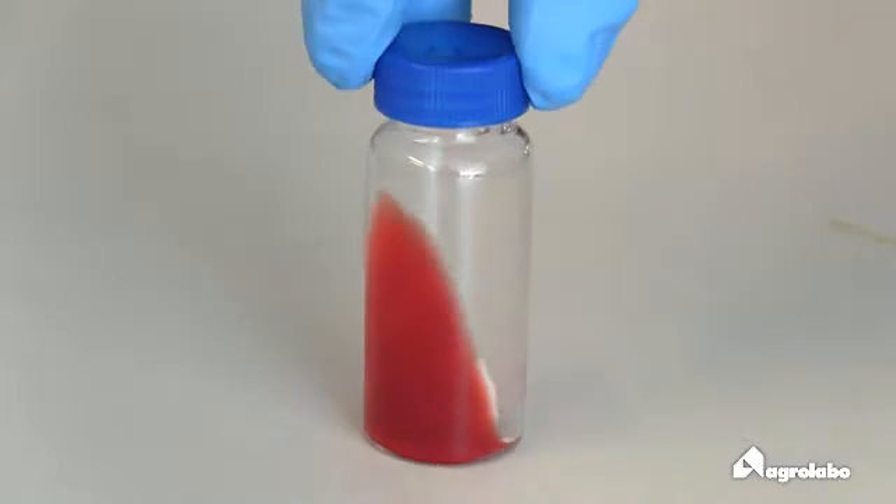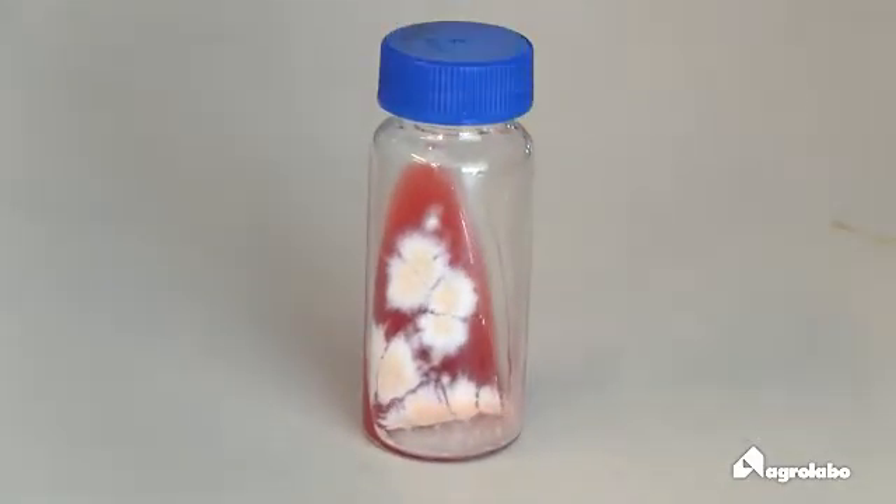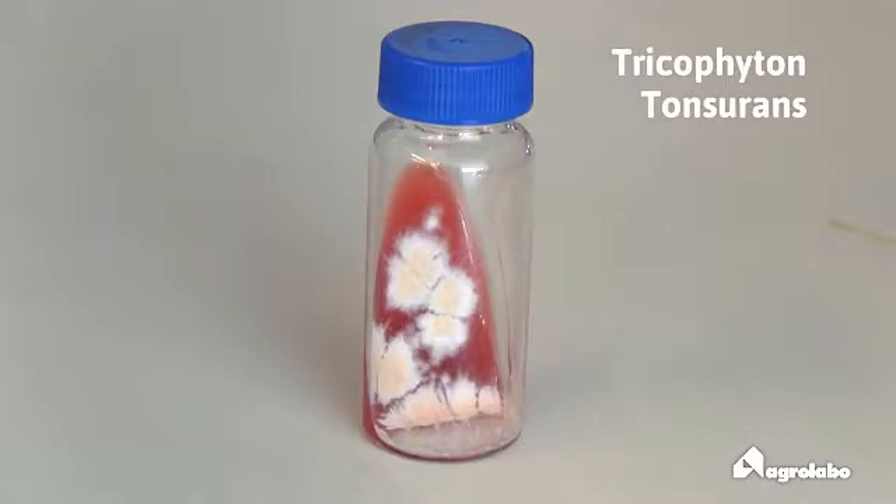The colony is powdery and velvety, first flat then in heaps. The color turns from cream to nut or from yellow to rose. Reverse side: from yellow to mahogany red.